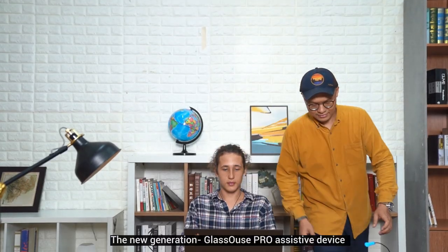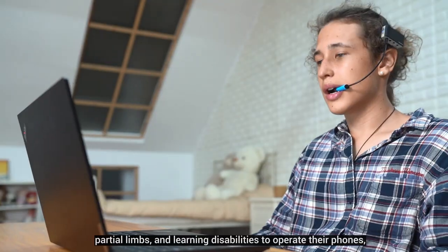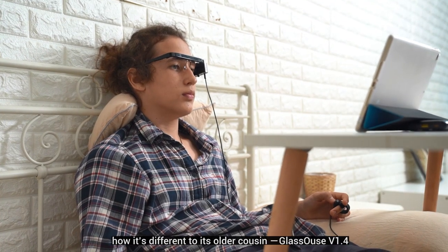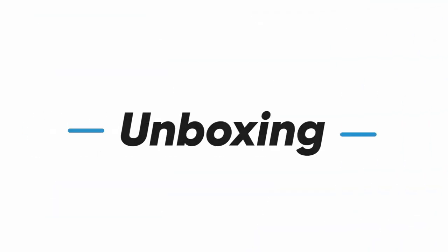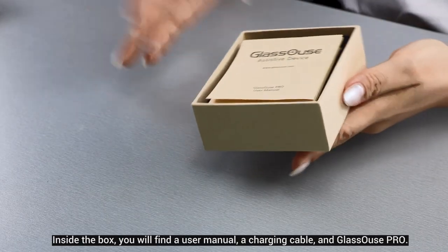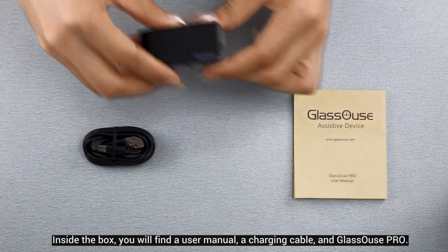The new generation GlassOuse PRO assistive device is a customized assisted wireless head mouse enabling individuals with limited mobility, partial limbs, and learning disabilities to operate their phones, computers, and tablets hands-free. Let's unbox it and review the functions, features, and how it's different from its older cousin, GlassOuse V1.4. Inside the box you will find a user manual, a charging cable, and the GlassOuse PRO.